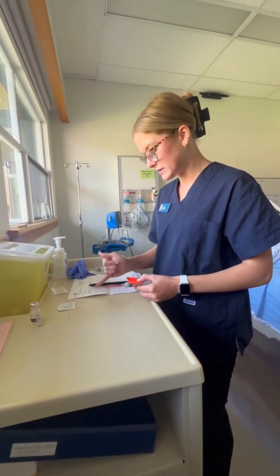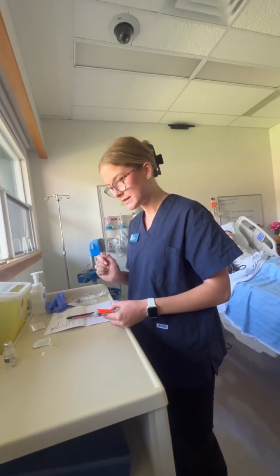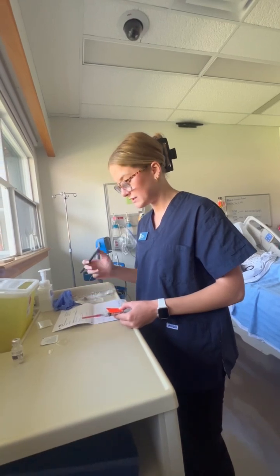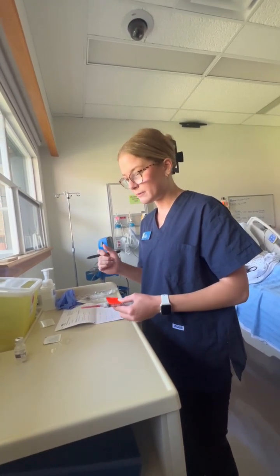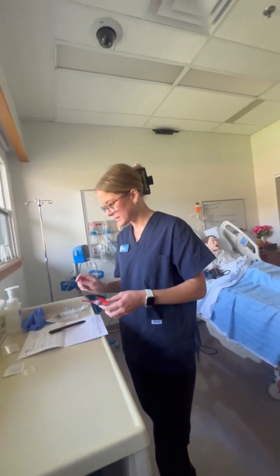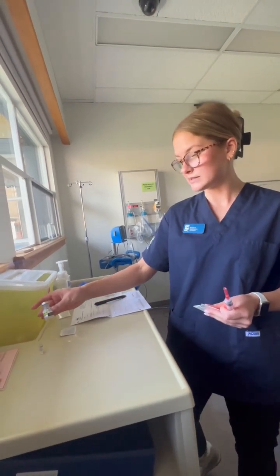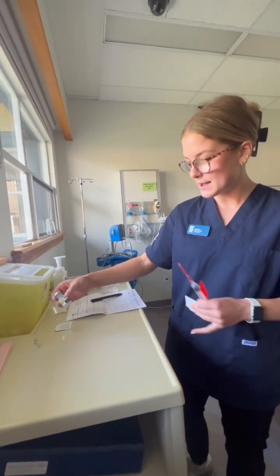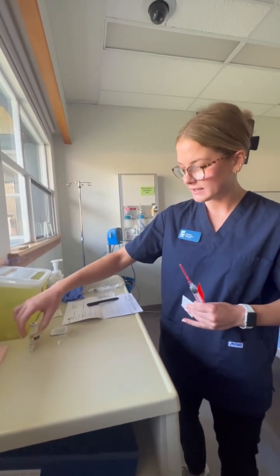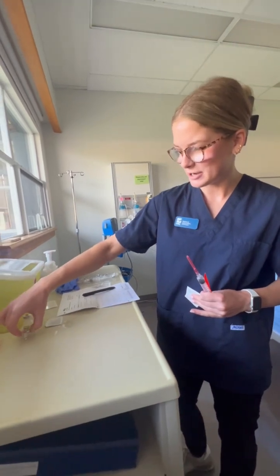Right route, I know that this has been ordered to give IV direct. I know from the IV monograph that I can give it direct. Right time, she has not received a dose yet, so it is okay to give. And the right reason, obviously, for her pain. So I am going to take this to the bedside with everything else that I need. I would also do my second check putting this away, but for the video purposes, I'm just going to leave these out. But I know expiry of the normal saline and as well expiry of the morphine here. Perfect.